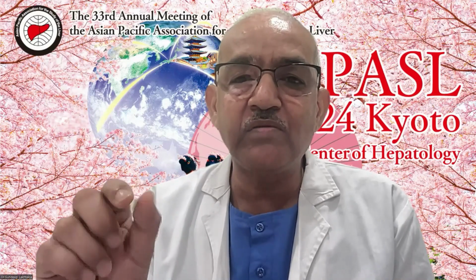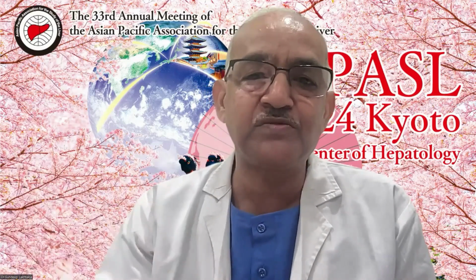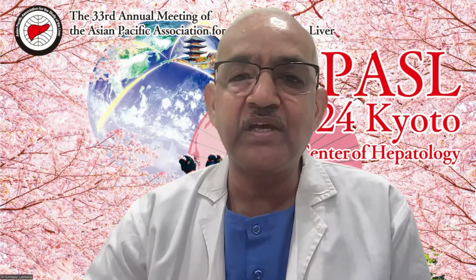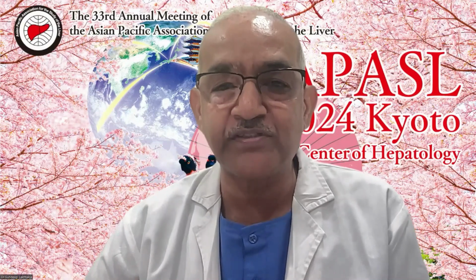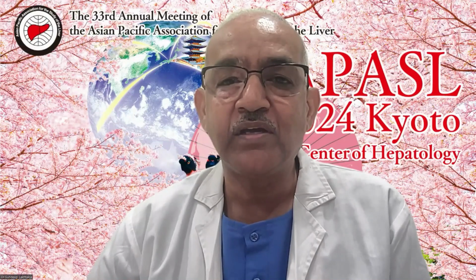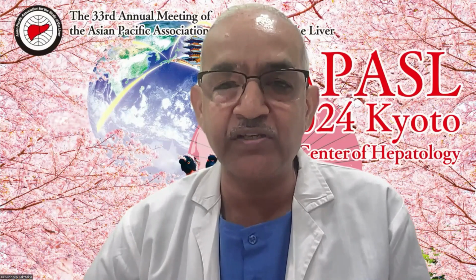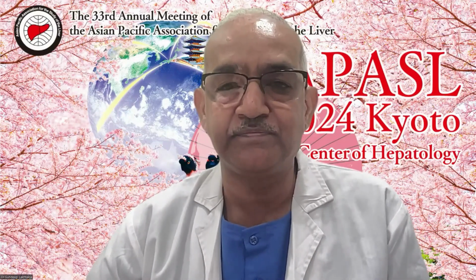That would prevent the inflow or outflow from the varix towards the extragastric side. There can be more than one perforator or collateral channel which needs to be addressed. Real-time Doppler helps us find these bunches of varices which may have more than one collateral, and these can be addressed at the same time or in quick succession over a few days.